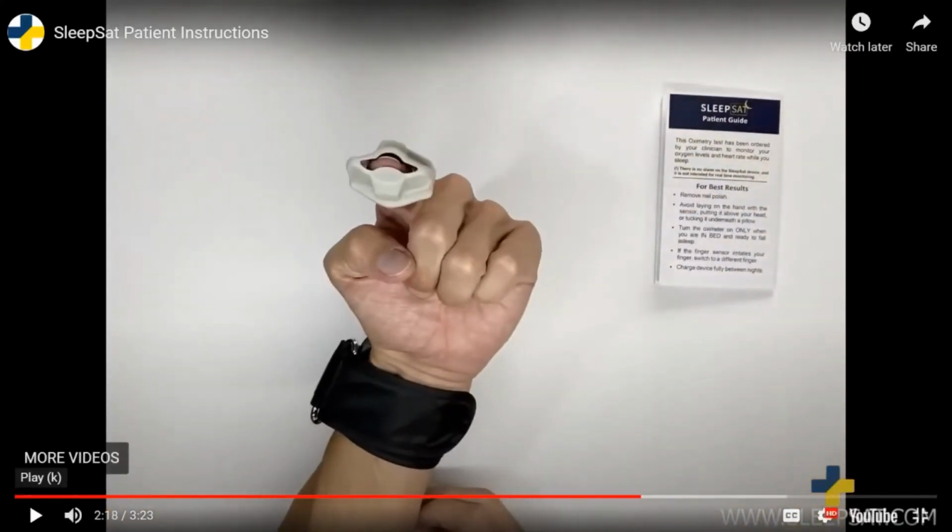All right, I do want to point out here, you can see at the end of the probe, there's a bump. Your finger should be touching that bump, not laying that bump down by having your finger sticking out of the other end of the probe. And your finger shouldn't just be floating around in the middle of the probe. It should be touching this small bump at the end of the probe. That'll ensure the best connection between the emitter here and the receiver here.